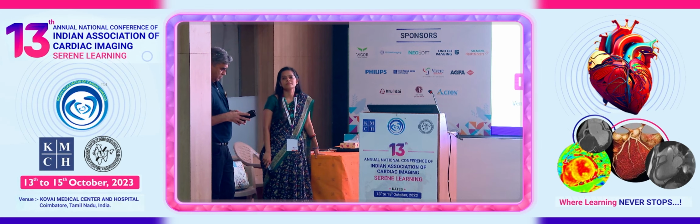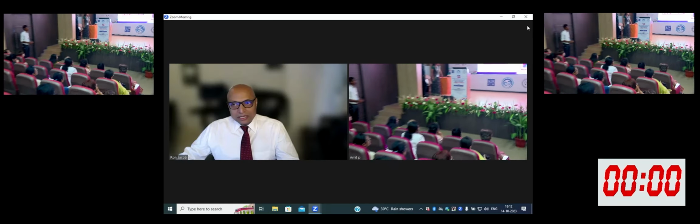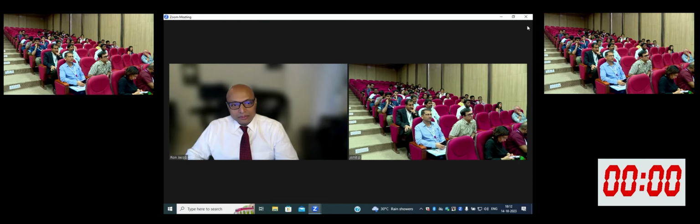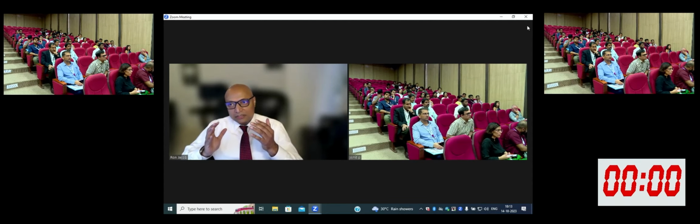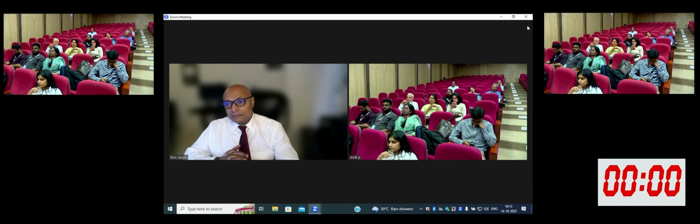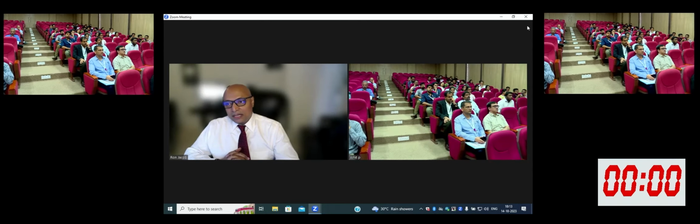The Moon paper just literally got published. I think arbitrary cutoffs, 1.5 and 1.6, sometimes can take us down the wrong road, because you can have people with apical HCM with smaller or more subtle degrees of hypertrophy. The appearance of the ventricle is really important. Look for the gradient. Normally, in a normal morphological ventricle, the apex usually thins out. And if you see that there's a discrepancy between the basal segments and the apical segments, then you should look at it a little closer and not be dogmatic about arbitrary values.